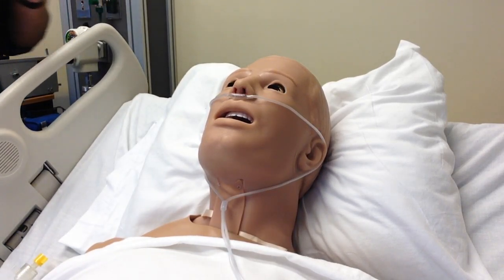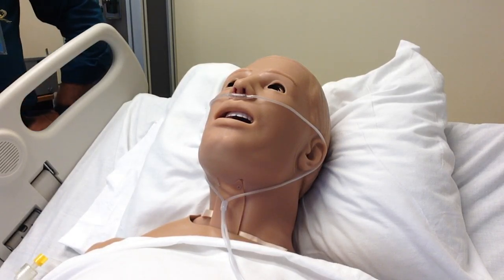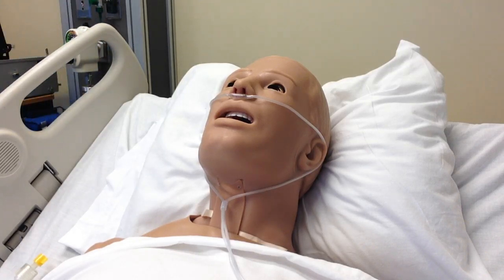So you'd set the ball on the flow meter at the oxygen level you want and read it from the middle of the ball. So in summary, this is a nasal cannula, a low flow oxygen device. The oxygen is approximate with the rule of 4. You can run it up to 6 liters per minute. Bubble through humidifier is typically utilized for 4, 5, or 6 liters per minute. If the patient is complaining of a dry nose, go ahead and put a bubble through humidifier on it. That is not a problem.